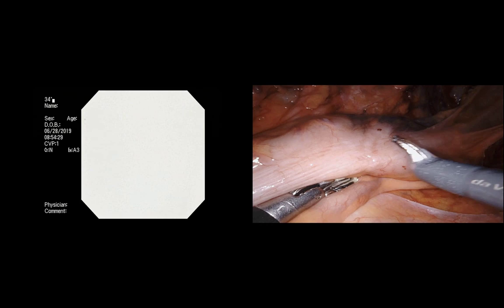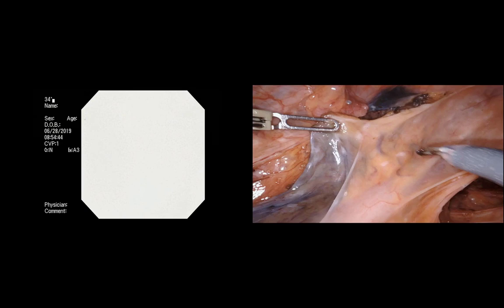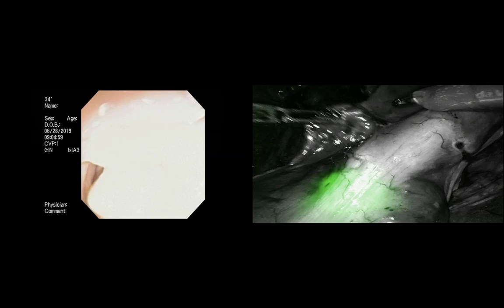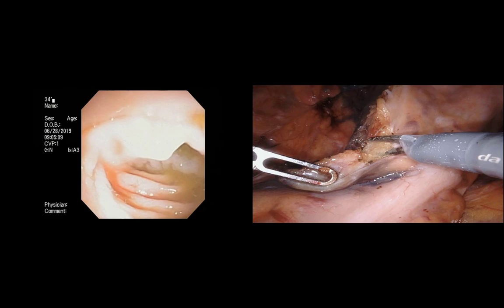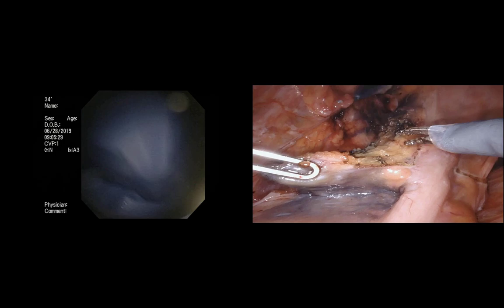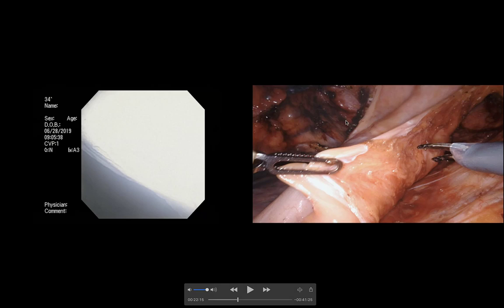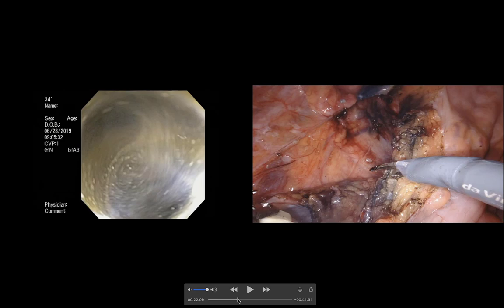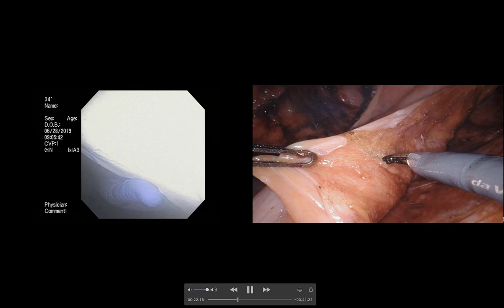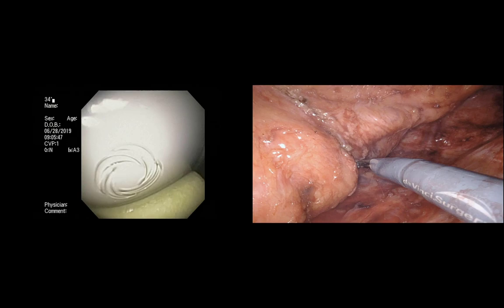The endoscope confirms the lower edge of the tumor — we're well below the tattoo, confirming what my GI colleagues outlined. Then I circumferentially score the rectum and meso-rectum as a landmark so I know exactly where to divide without skiving. The posterior circumferential scoring is done right now, purely for landmarks.